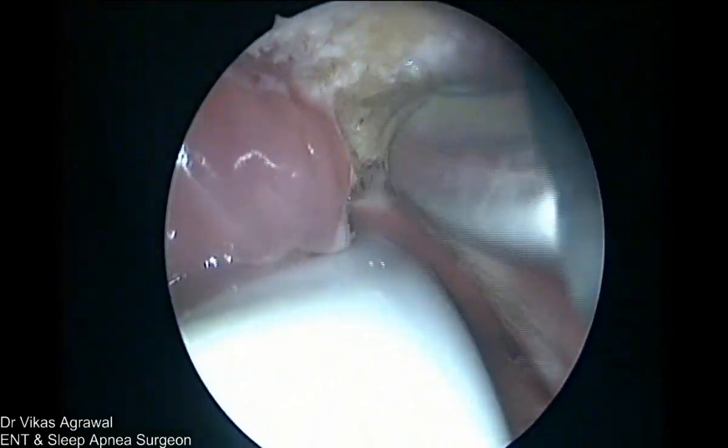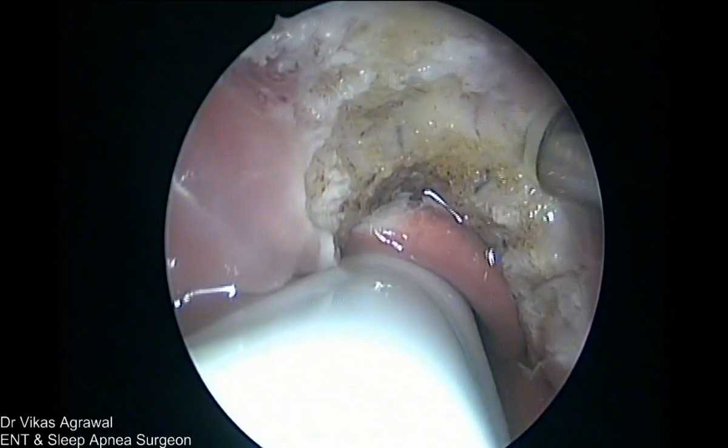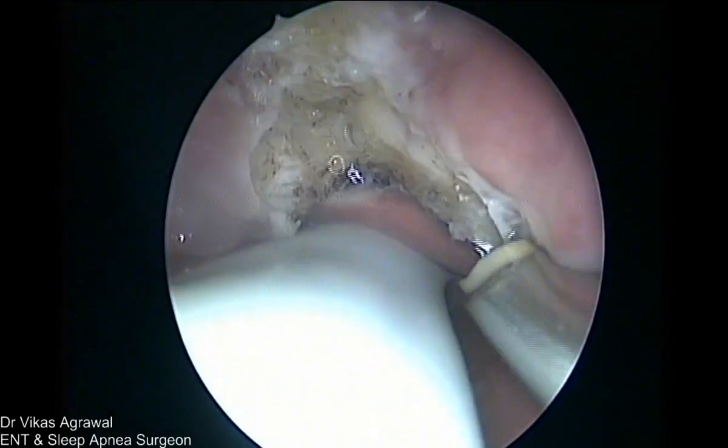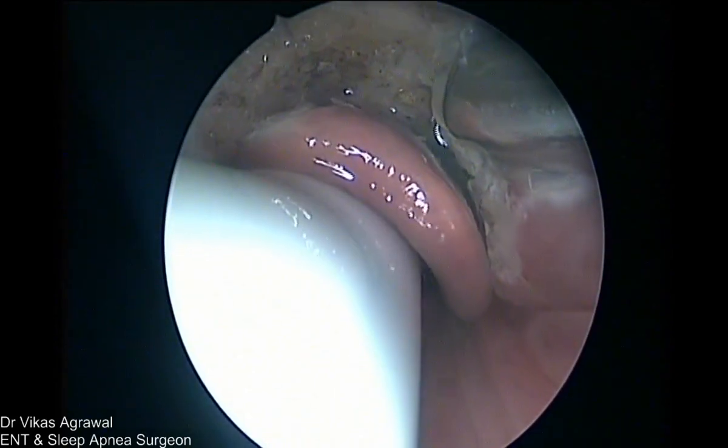Yeah, what is the question? There's a question from Balagopal Kurup on YouTube. Yes, Dr. Balagopal: is immediate post-op sleep endoscopy of any use to predict healing? And does the ultimate result vary a lot due to the healing?